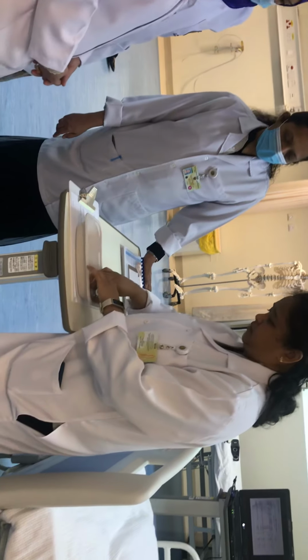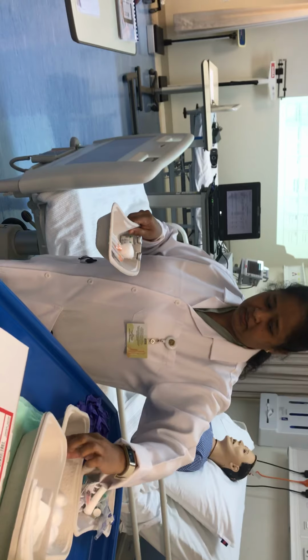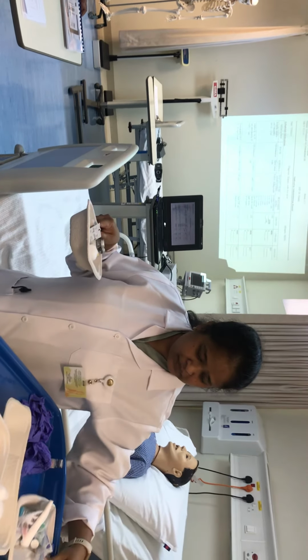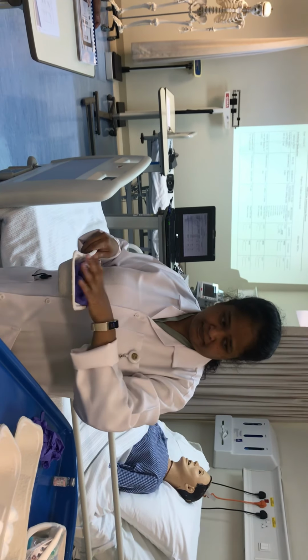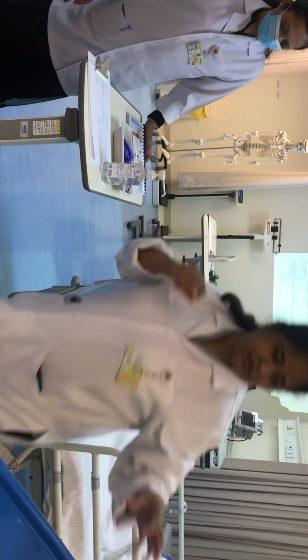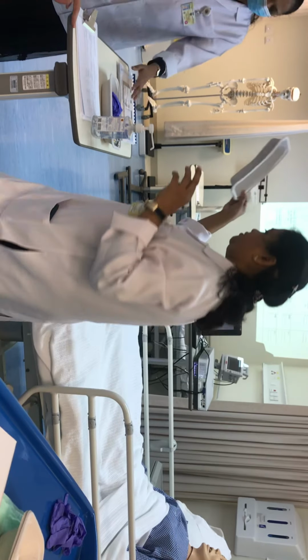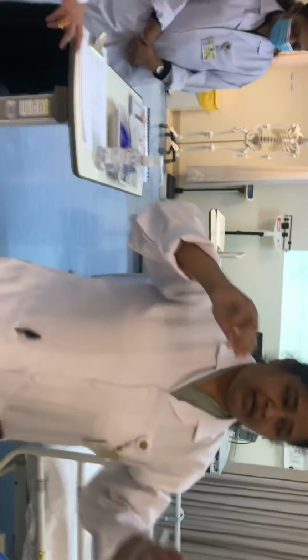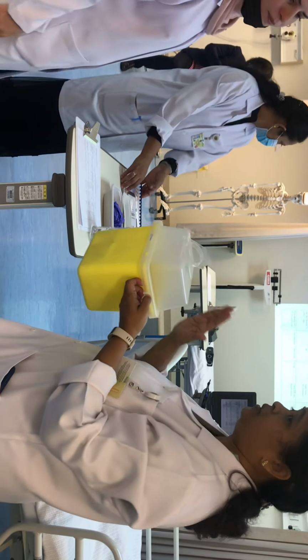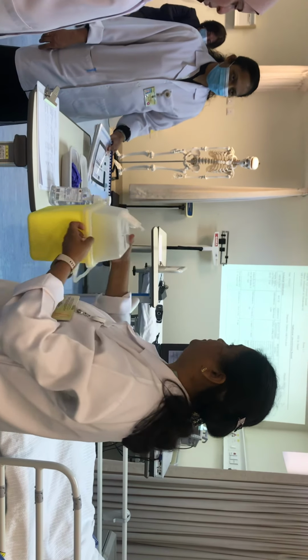So collect all these things. What are all the things I need? I need cotton. I need 2 alcohol swabs, I will tell you why. Gloves I need. Anything else? Hand wash. And always, if kidney trays are available, please take 1 more, and a test box. And also a sharp container. In the hospital also, for students to take to the bedside, they have small sharp containers. So we should insist they take it to the bedside.